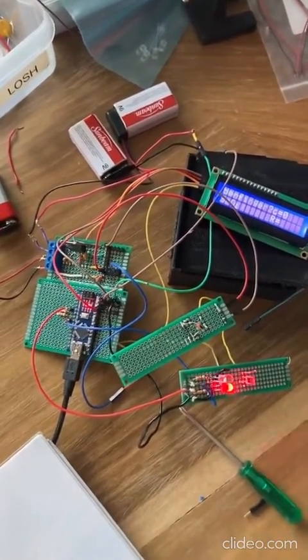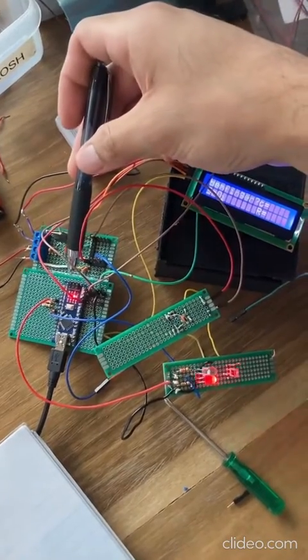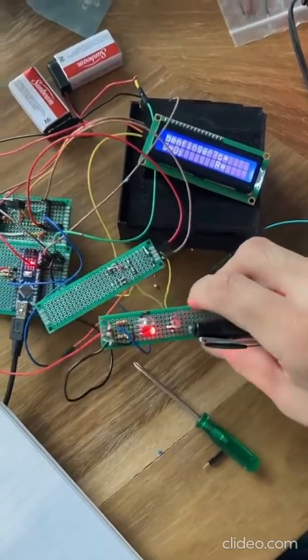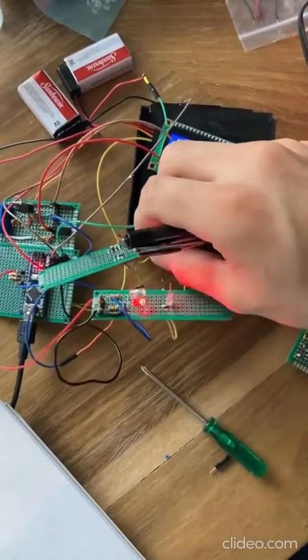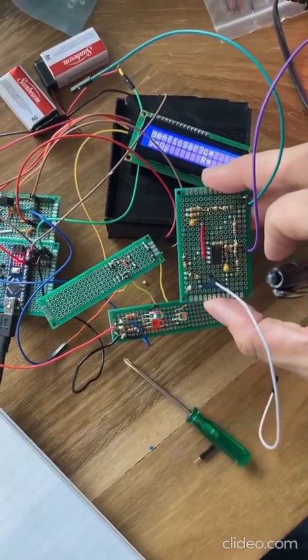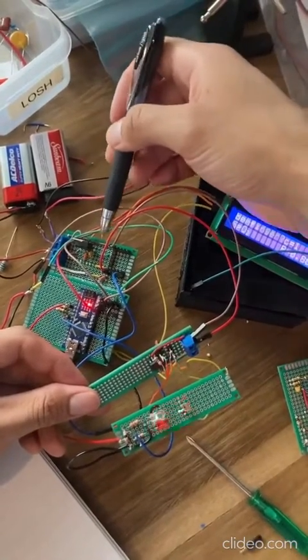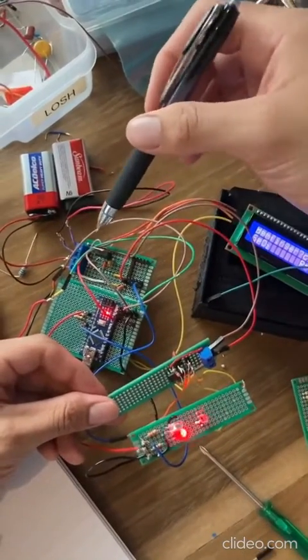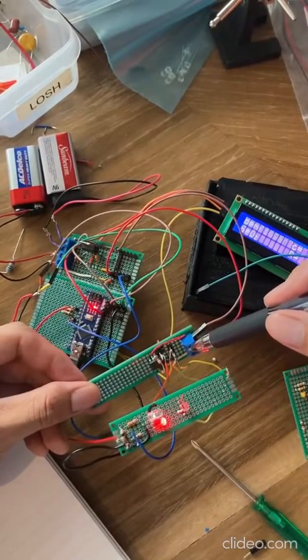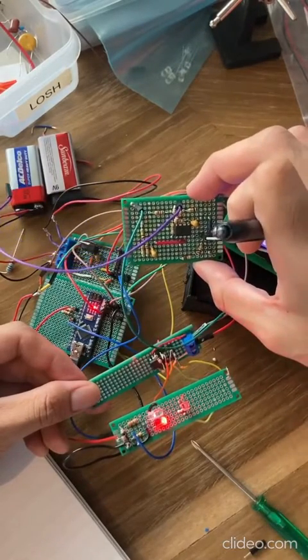We are group 3. Our design is the pulse oximeter, which consists of a microcontroller, Arduino Nano, an optical module, a TIA transimpedance amplifier, and also a bandpass filter. Here is a power supply that powers up the transimpedance amplifier, which needs a positive and negative voltage. And also the power supply powers up the band filter here.